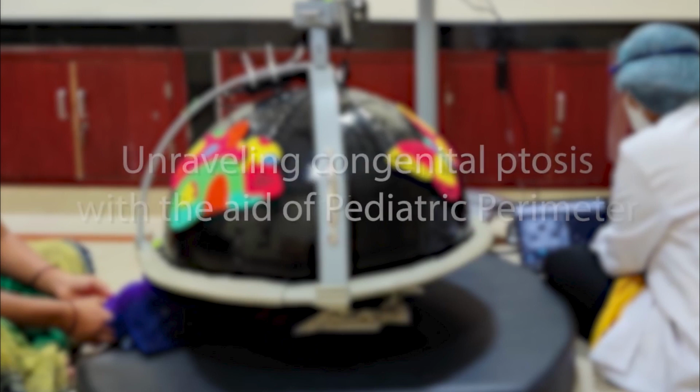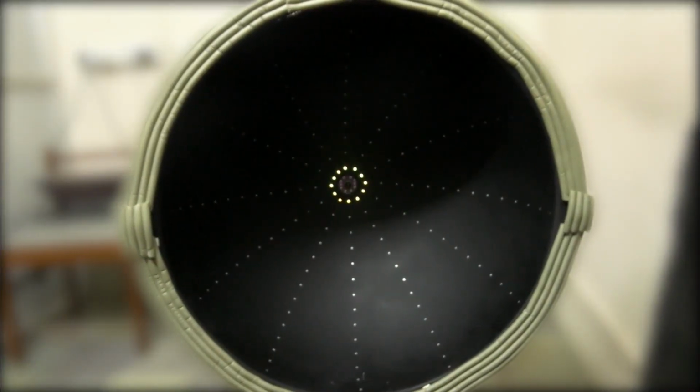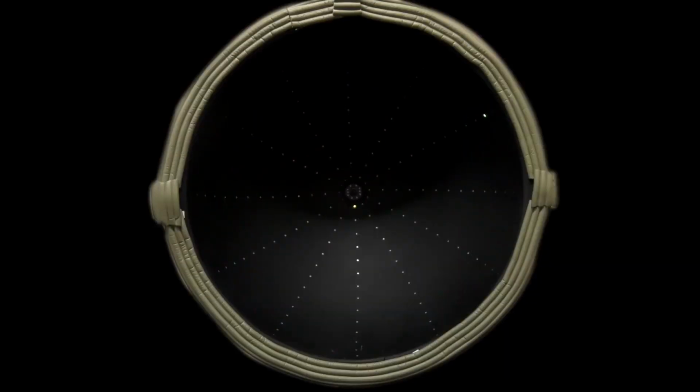In this video, we would like to highlight an incidental diagnosis of an unusual strabismus using the pediatric perimeter device. The pediatric perimeter consists of a hemispherical dome with light-emitting diodes that are controlled through a computer using custom-built software. Both static and kinetic stimuli can be shown in this device.